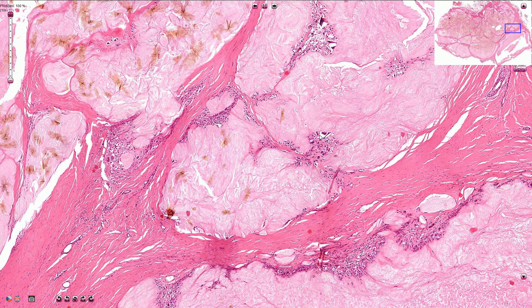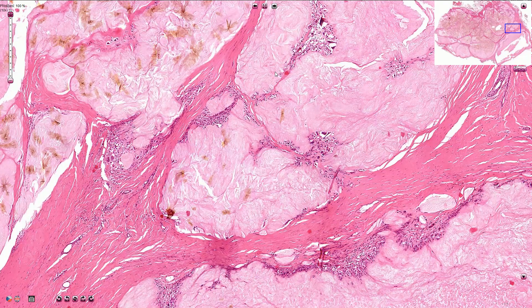In order to see the gout crystals in polarized light you need to fix the material in alcohol — at least that's written in all the textbooks. But I really recommend watching the great video made by excellent pathologist Jared Gardner, who found out that if you take a normal unstained slide from a paraffin-embedded block fixed in formaldehyde, you can see the gout crystals in a polarized microscope. He also showed an amazing psychedelic effect if you turn the polarized filter.